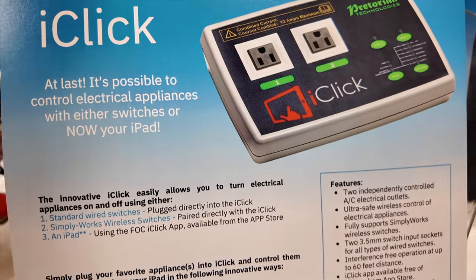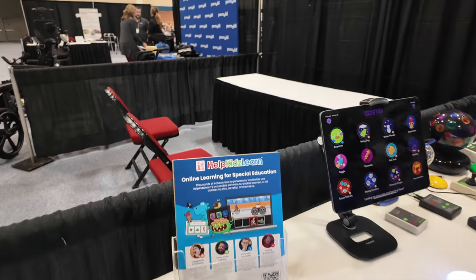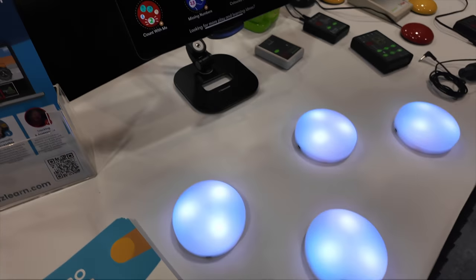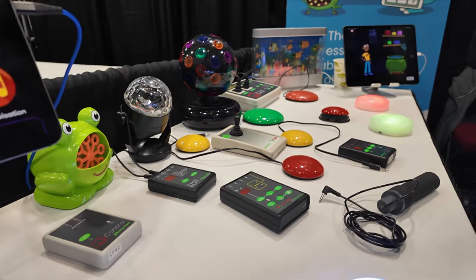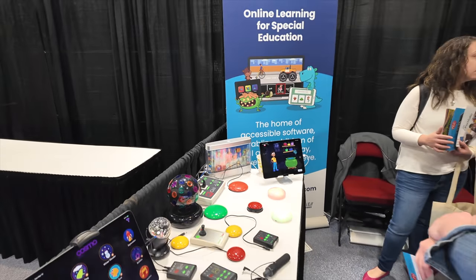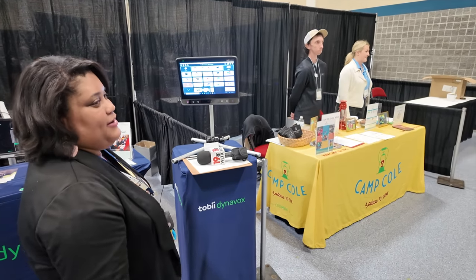Switches as well. I don't know if you're familiar with these power packs. This is a sign of the switch. For those who like the auditory feedback from the switch, something like this also helps. Doesn't stop it happening. But are you familiar with how the kids learn? I've seen some stuff before. And that's how a child might participate in shared reading with Brown Bear with their eyes.